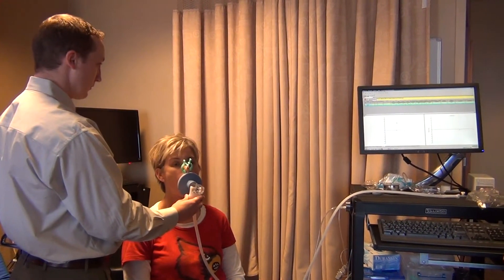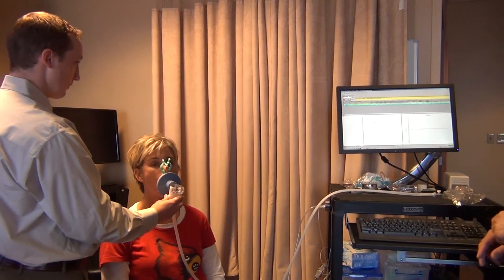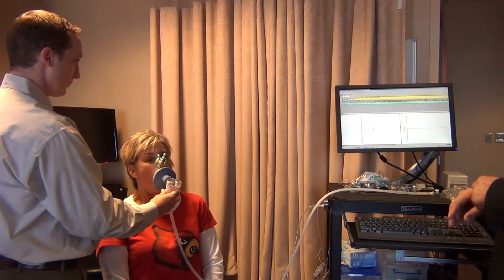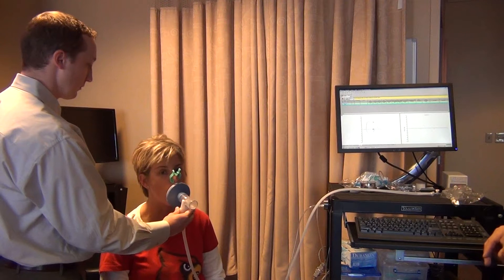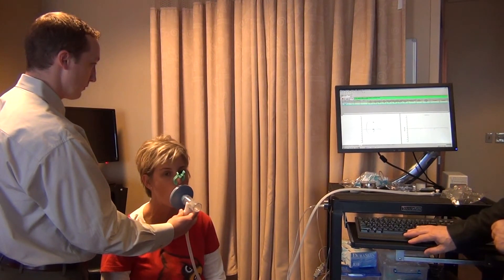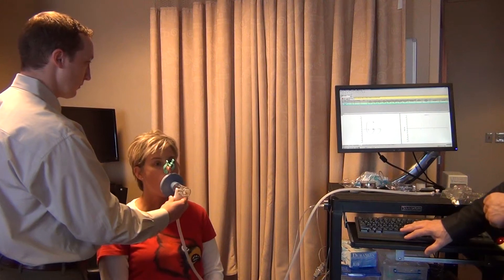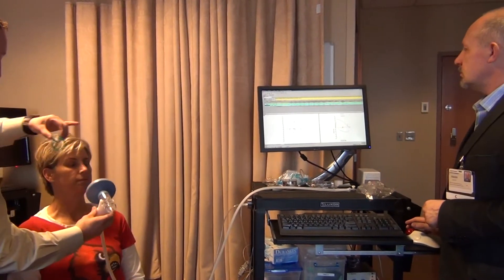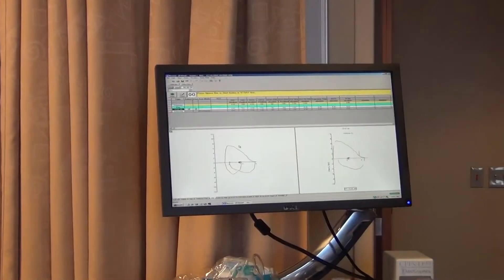Breathe normally. Breathe normally. Deep breath in. Push, push, push, push. Push, push, push. Take it in. Done. So that was one successful trial. I would like to do a set of three.